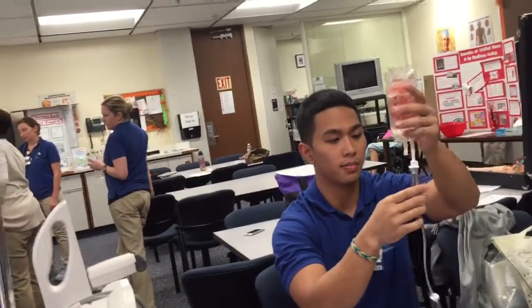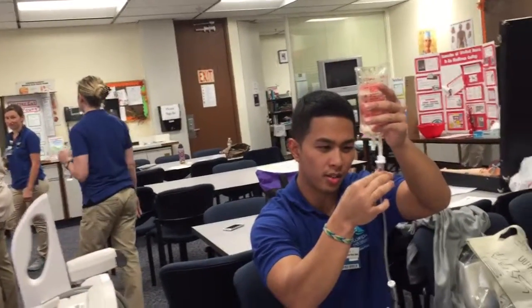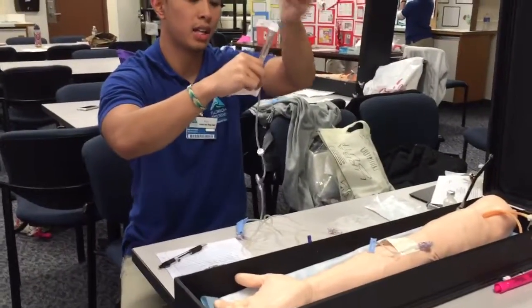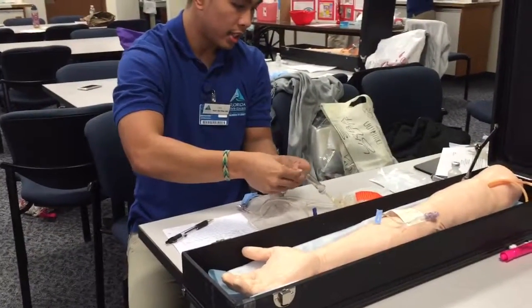I'm going to flip it over. I'm going to prime it up to about, there's a line here, so it's about a third of the way up. And then this is a tubing, so I'm going to also label the tubing with my initials, the date, and the time, so that it can probably be changed when it needs to. So that is good right there.